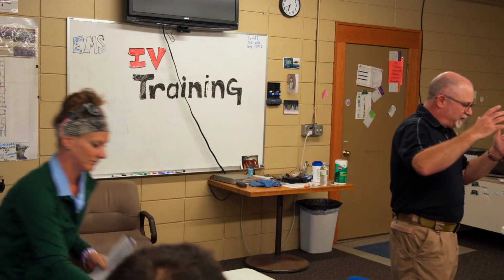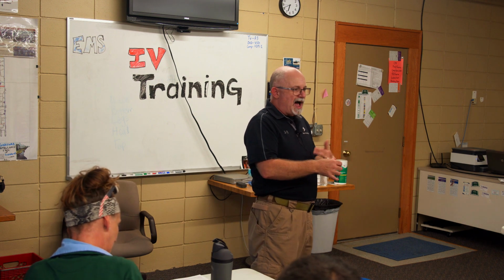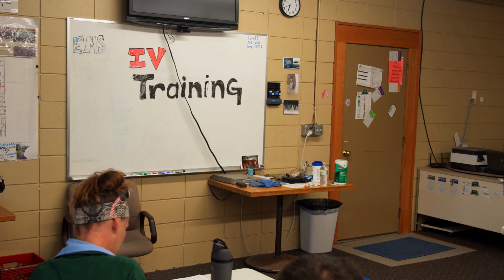Anyway, back to that. So the EMTs can do it. EMRs can assist. What we're going to cover in a little bit is the why. Why might we want to, or what would be the indications for establishing intravenous access?